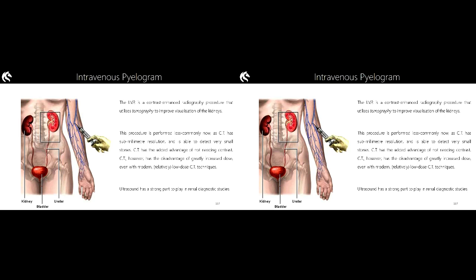It requires a radiologist or medical officer interaction, and they can be hard to find, and more particularly an IVP, an intravenous pyelogram, requires specialised equipment. It requires a tomography unit, which is a mechanical hardware modification to a standard X-ray room setup.